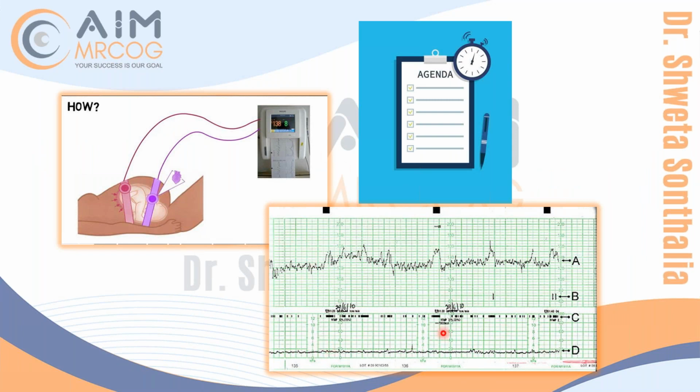Today's agenda is to understand CTG. This is how the CTG recording looks, and this is how the monitoring is done. This is the contraction probe, which is attached on the fundus of the uterus to record the contractions, which are recorded here. And this is the fetal heart probe, which is put near the anterior shoulder of the baby to record the fetal heart and get a trace of it. So this is how CTG is monitored. This is how the machine looks, and the printer prints the recording of the fetal heart.